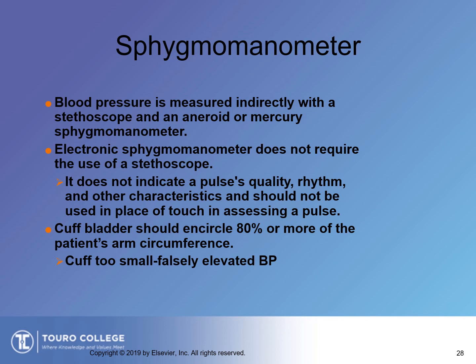The biggest thing, I'm sure that you all have taken a zillion blood pressures in your life, okay? Most places use electronic sphygmomanometers. We don't. We use the old-fashioned cuff, and the old-fashioned cuff is actually the most accurate.